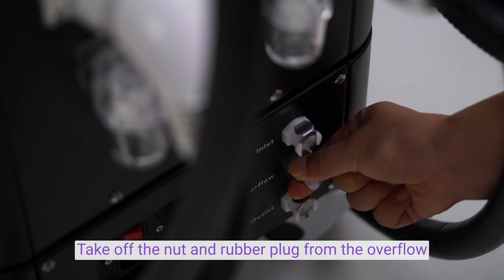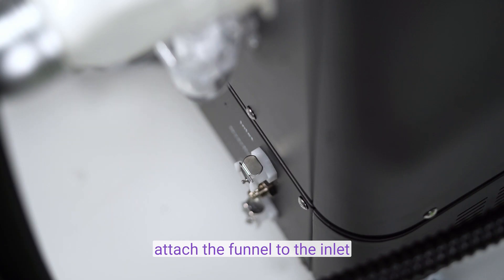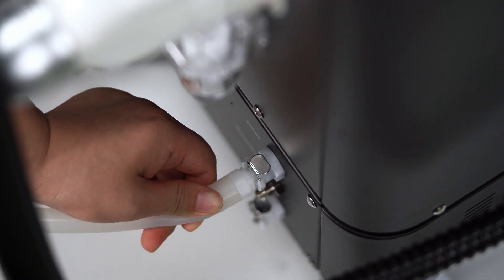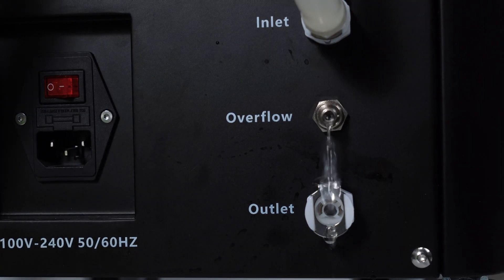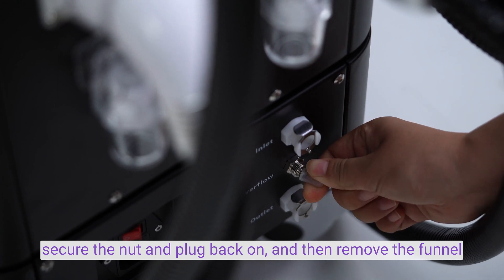Take off the nut and rubber plug from the overflow. Attach the funnel to the inlet. Pour water through the funnel until it starts flowing out from the overflow. Secure the nut and plug back on, and then remove the funnel.